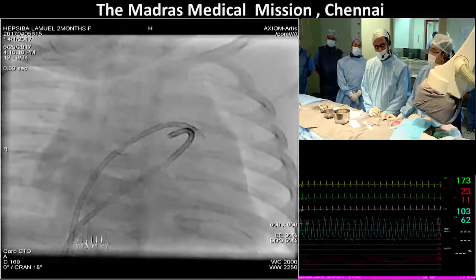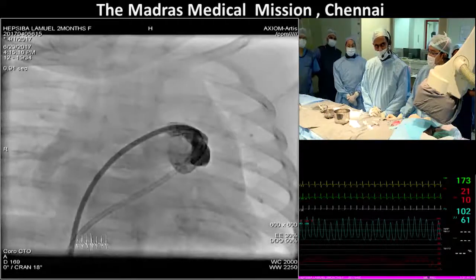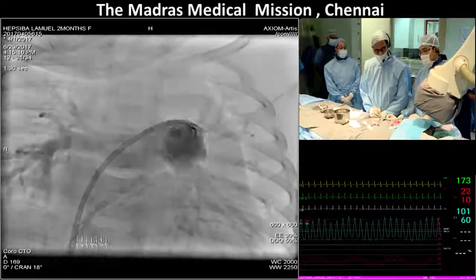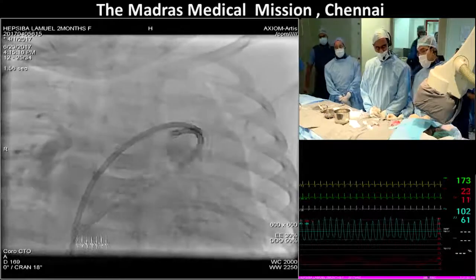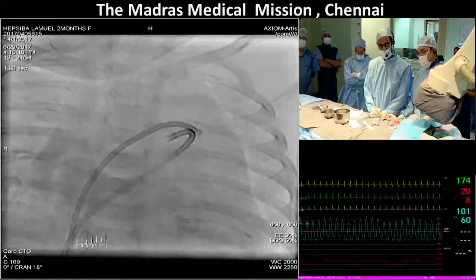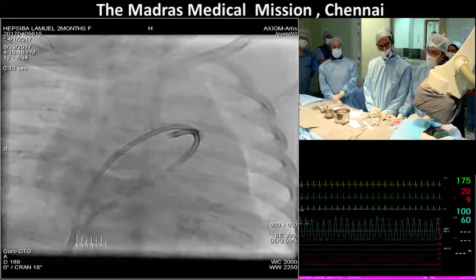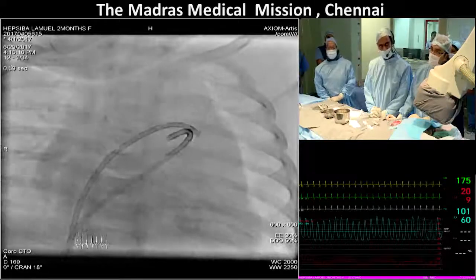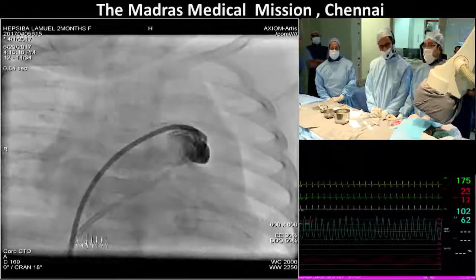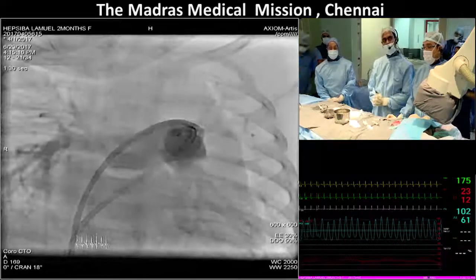I'm a little tiny bit speechless here. I don't know, in the 30 years that I've been in Boston, we've probably done 50,000, 60,000 catheterizations, and I don't think I've seen this more than twice. Whatever this is, it is extremely unusual. And as a result, I'm sure transcatheter therapy makes sense here, but you're going to be making this up as you go along, which we've never done before, actually, in the history of the field. So I'm very interested to see how you're going to handle this.